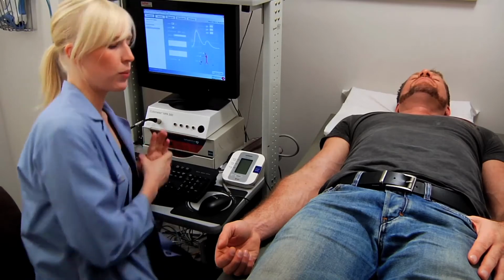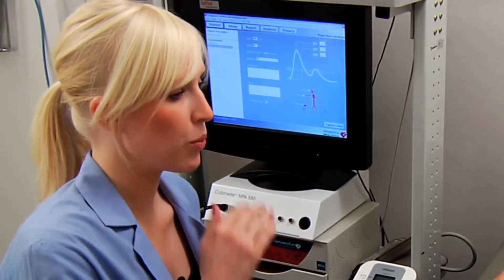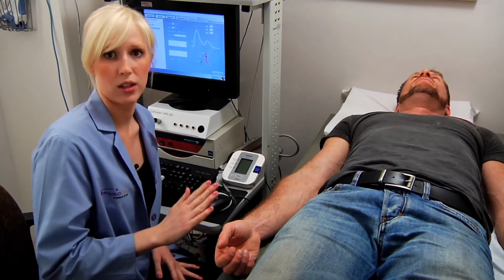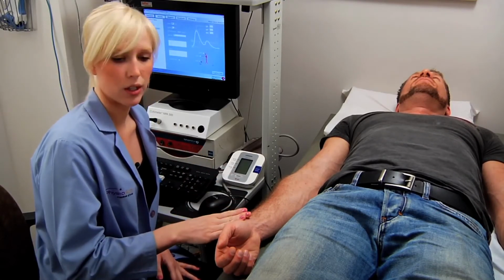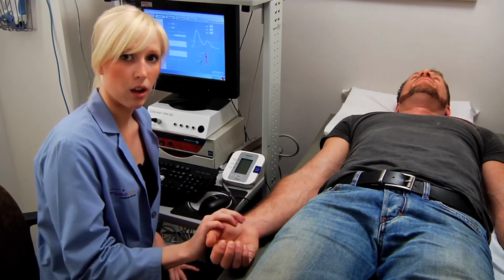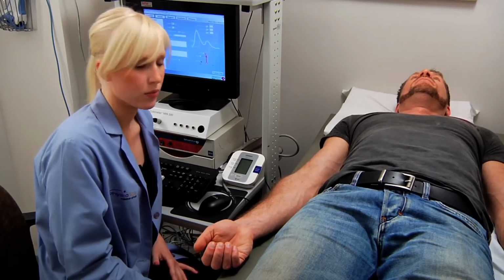Okay, so now I'm going to prepare my patient for this test. The patient positioning is important because you want the patient to be lying completely flat on their back, rested. Their legs have to be uncrossed for their entire resting period and during the test. So at this point, you'll tell the patient, okay, I'm going to have you lay flat, your palms facing up, or facing the ceiling, and your legs are uncrossed.